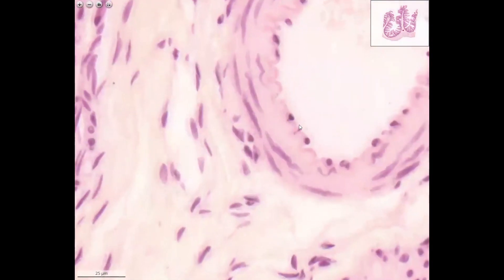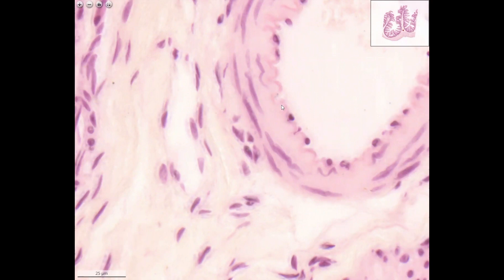In this blood vessel you also see the endothelial cells and the internal elastic membrane. About the final structure of the arteries you will hear more at the end of the semester.